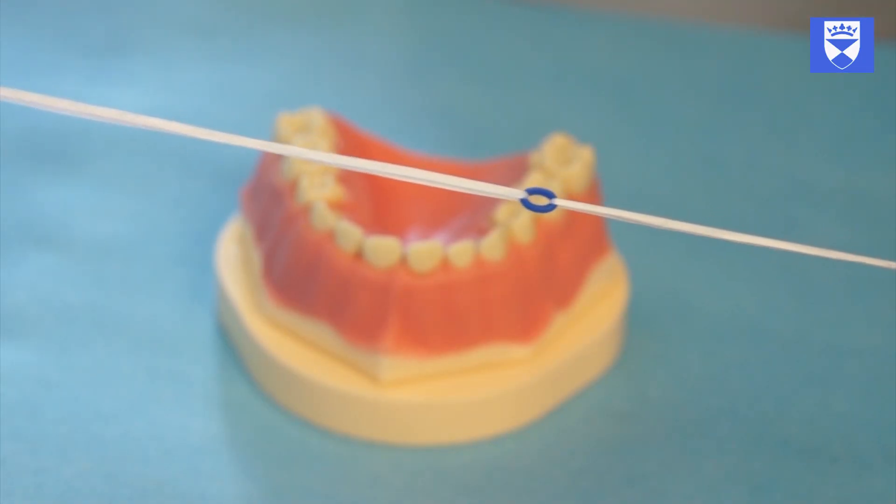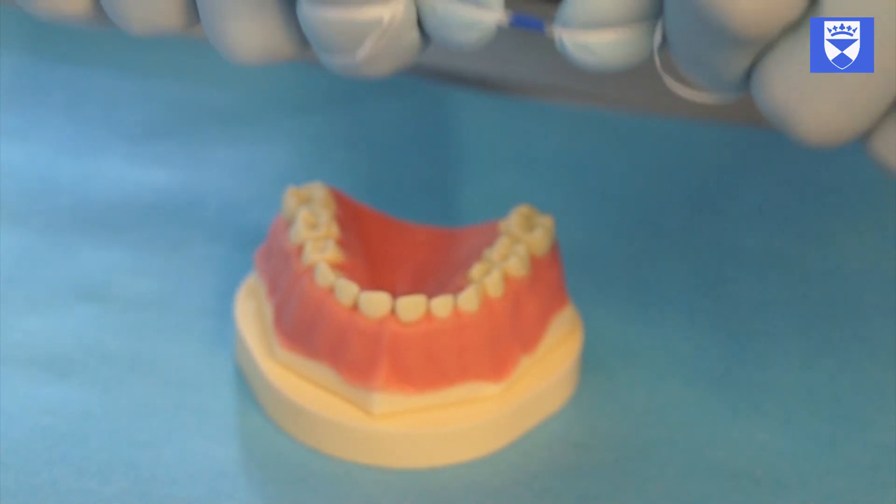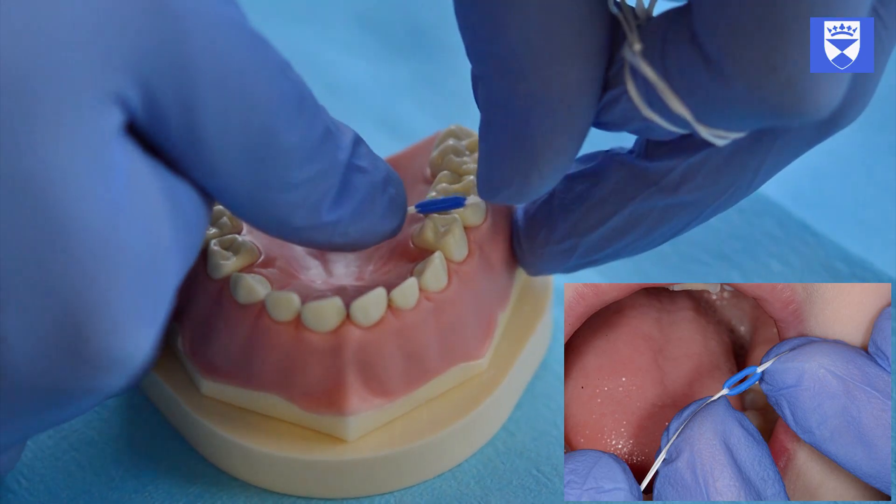Thread two pieces of floss through the orthodontic separator, ensuring that the floss strands do not cross. Grasp the floss between your thumb and index finger and apply tension to the band.